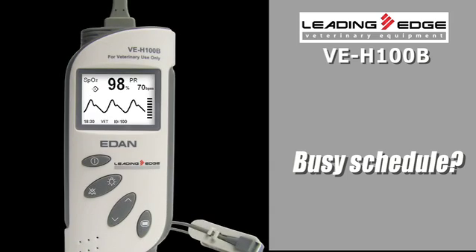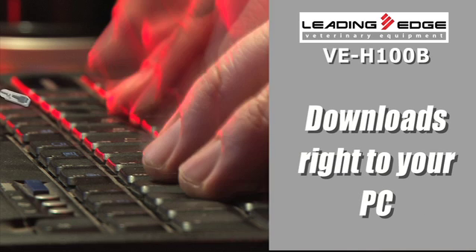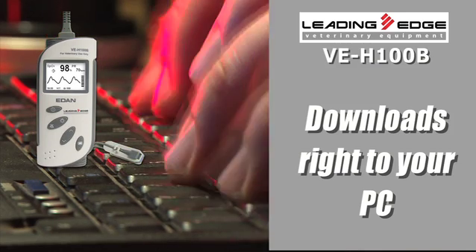If you have a busy schedule and don't have time to transfer the data, rest easy. The Leading Edge VE-H100B can hold a staggering 300 hours of complex information before you have to download, and it goes right to your PC — no need to hunt around for a printer like with other pulse oximeters on the market.